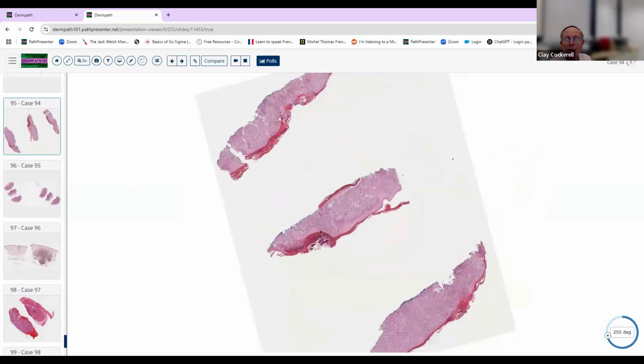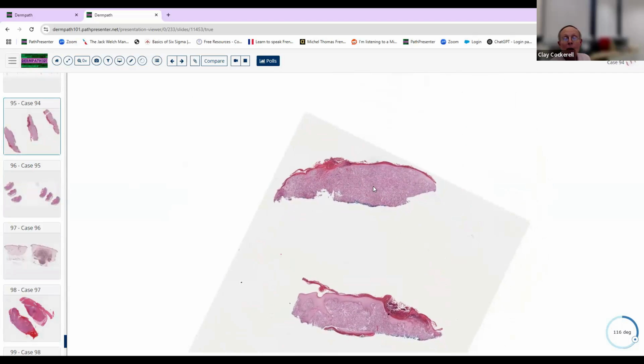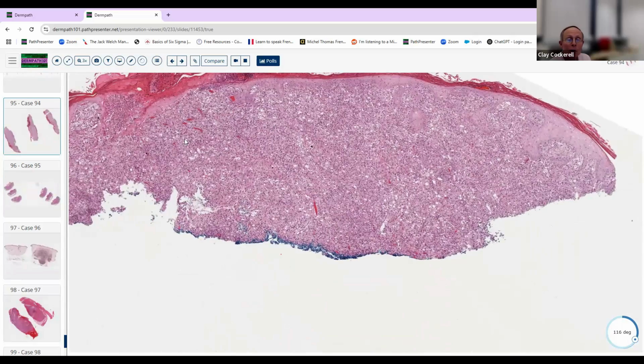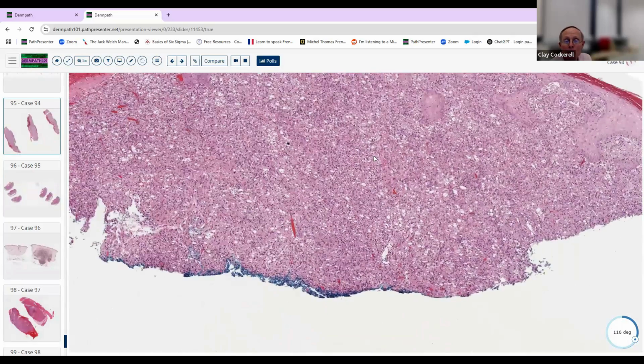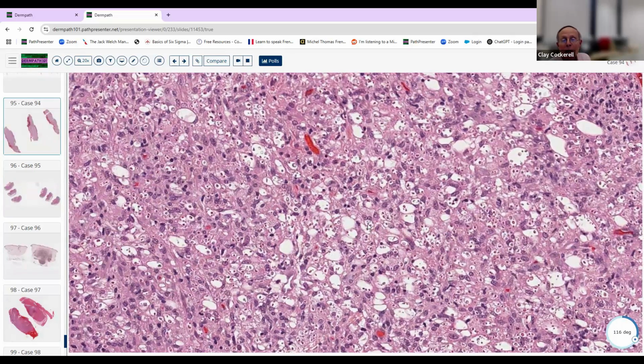Next one. Another dense diffuse infiltrate here. Okay. Back to inflammatory. We see some pale stuff going on in here again. We start wondering if there are histiocytes in here. We start looking. And wow, look at all these cells in here. Small round cells with this abundant clear material, capsular material. Fairly large cells, larger than the tiny cells of histo, which have a tiny little capsule, not this gelatinous-like capsule.